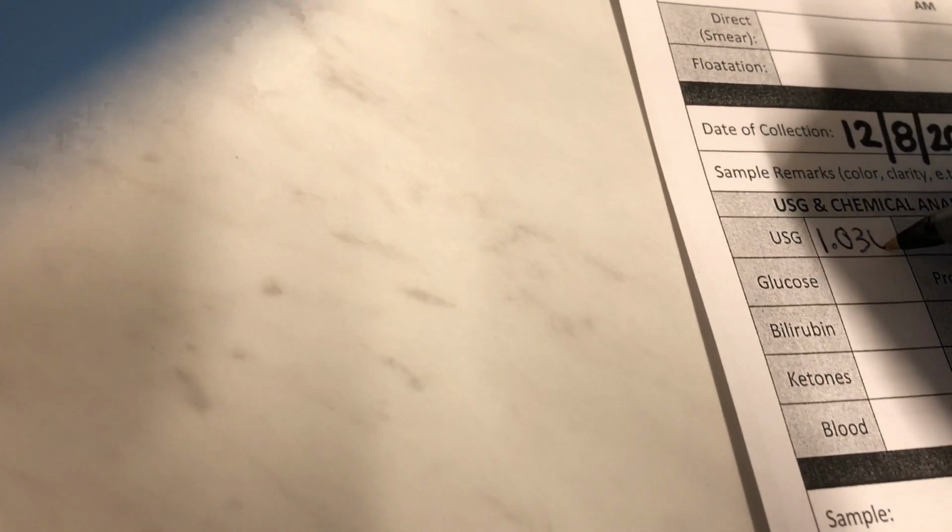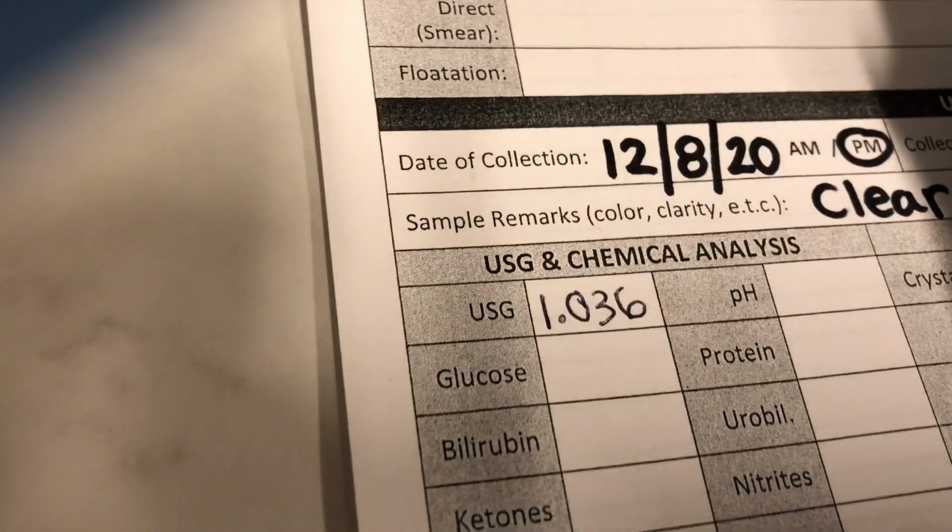Urine specific gravity, USG, was 1036, which is actually written as 1.036.